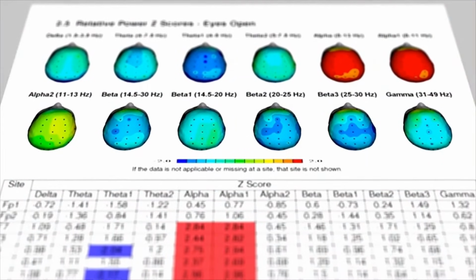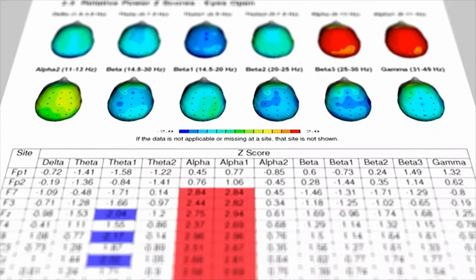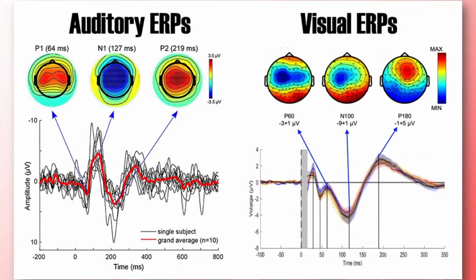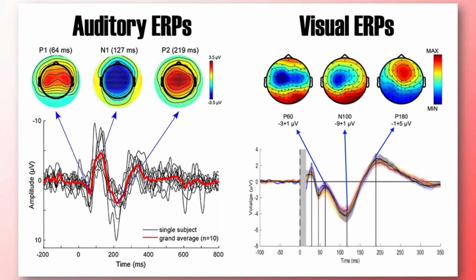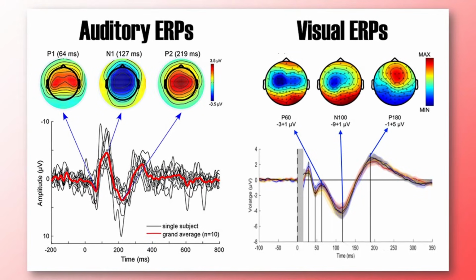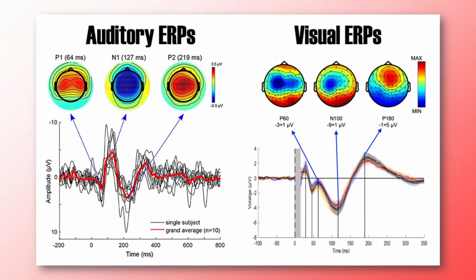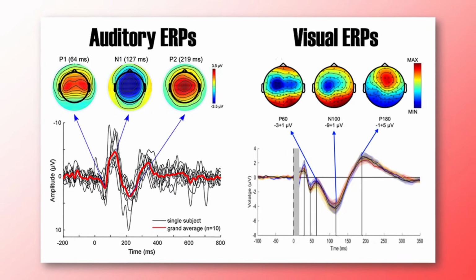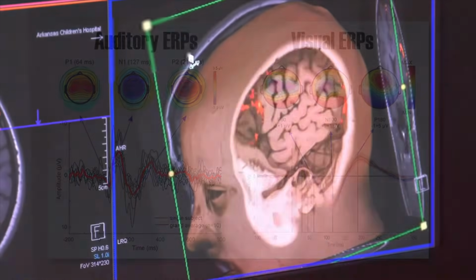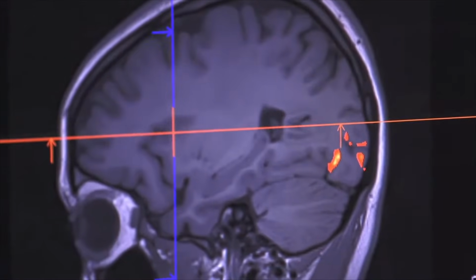It is also important to consider where an event-related potential comes from, since the same names can be used for different processes. For example, components N1 and P1 that originate from the visual cortex reflect basic visual processes. But the same nomenclature, N1 and P1, is also used for ERPs that come from the auditory cortex, and there they reflect basic auditory processing. So when discussing ERPs, the abbreviation is not enough. You also have to specify where the ERP comes from or to which process it is related.